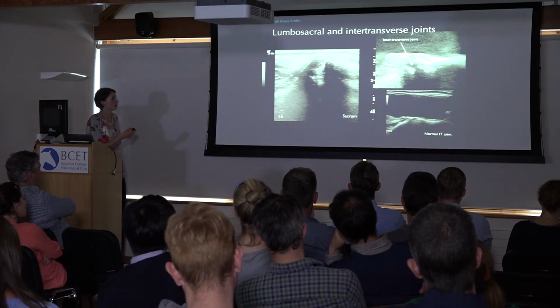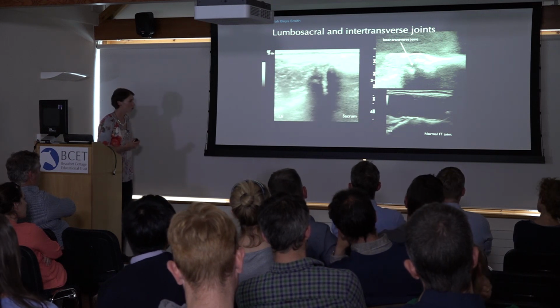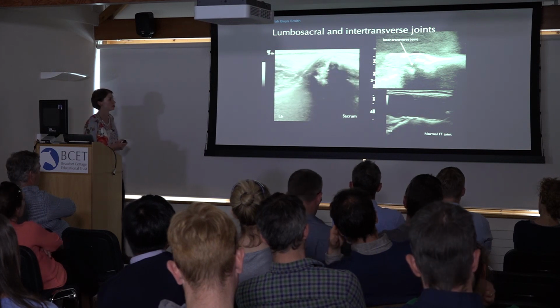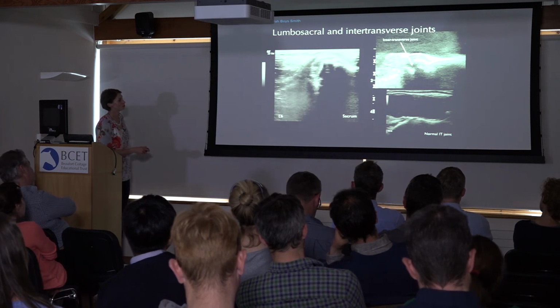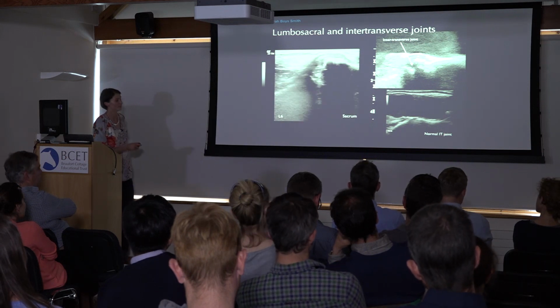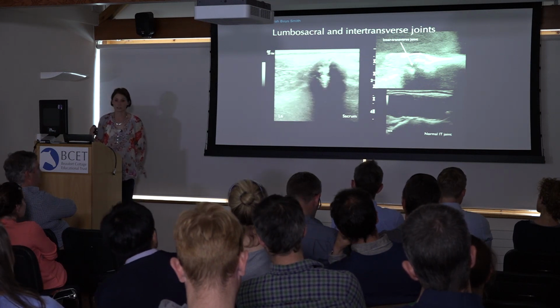This was a nice case. It presented with a severe, acute onset hind limb lameness after a fall, slightly ataxic behind as well. And we've got obvious disruption of this lumbosacral disc area. We've got disruption of the intertransverse joint compared to what it should normally be. And I think this case highlights that there's a lot we can't see ultrasonographically.